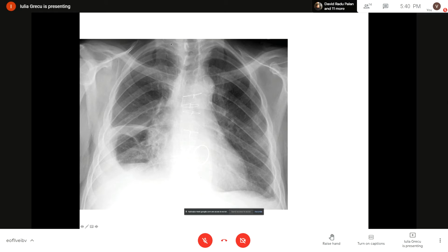I start with the posterior. So here is the first: 1, 2, 3, 4, 5, 6, 7, 8, 9. It's at the limit, but it's fine. Okay, Alim, that was very good.